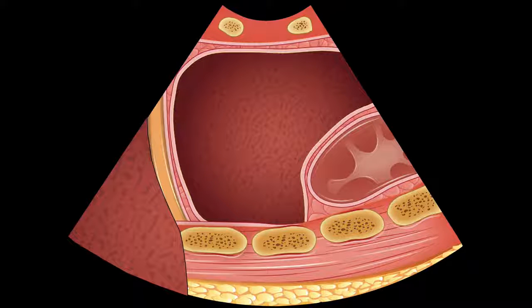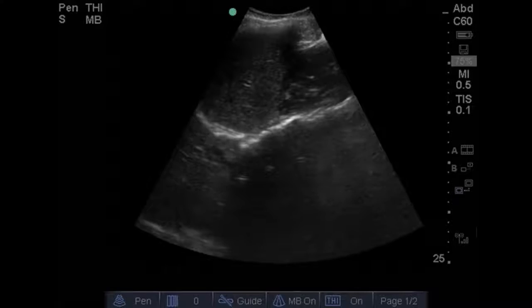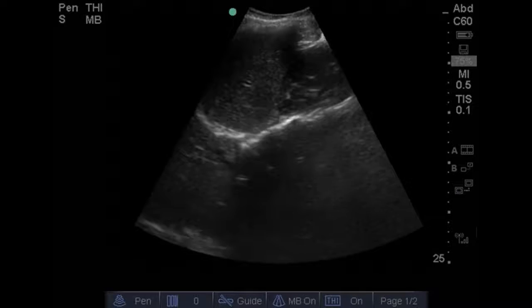This is called a mirroring artifact because the area above the diaphragm is mirrored from the area below due to the reflection. This is a normal artifact that will tell you there is aerated lung above the diaphragm. And you can see this because the spinal stripe stops at the diaphragm, and as we all know, the spine does continue past the diaphragm, but what we see above the diaphragm is the absence of the spinal stripe and the presence of what appears to be liver.